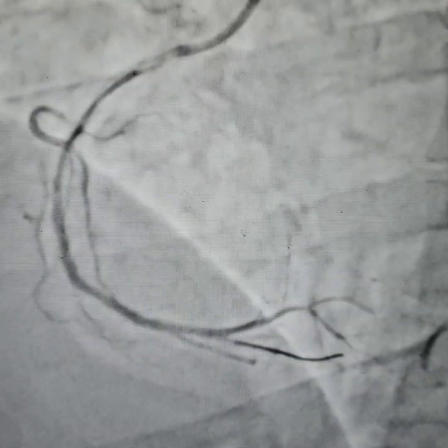This is the stent that we are putting — it is a 2.75 by 32mm stent. You can see the stent placement here and the stent is being inflated. We are post-dilating it with the stent balloon.